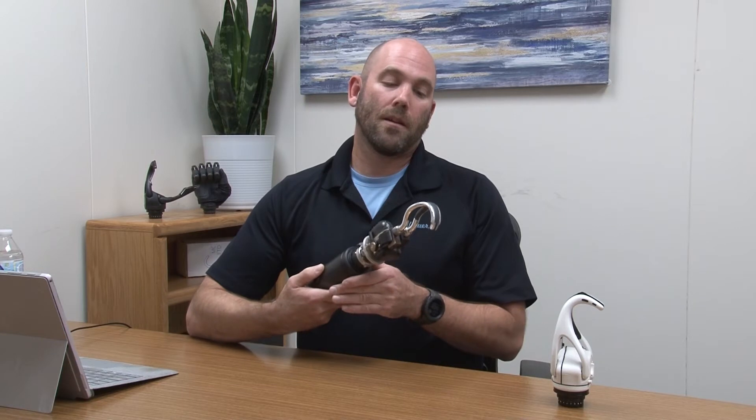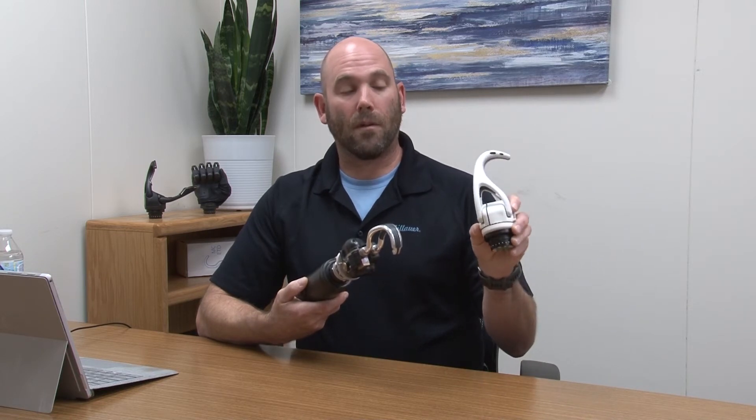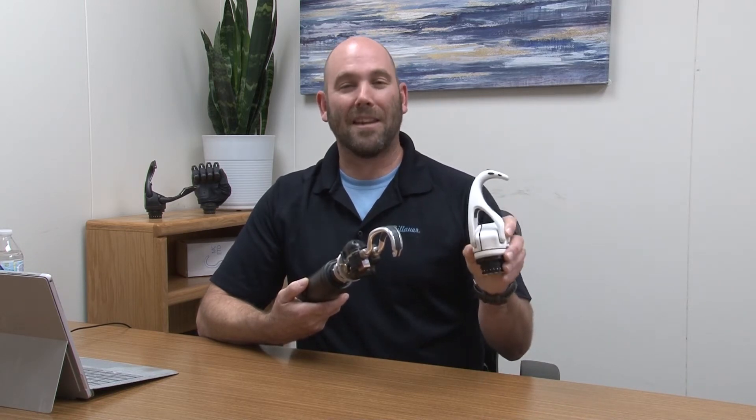Good morning. My name is Nate Sprunger and I'm one of the clinical educators here at Fillauer Motion Control. We have designed one of the most robust and popular myoelectric hook devices out there on the market. Today we're going to talk about the ETD, Electric Terminal Device, and we're also going to talk about the second generation Electric Terminal Device, the ETD2.